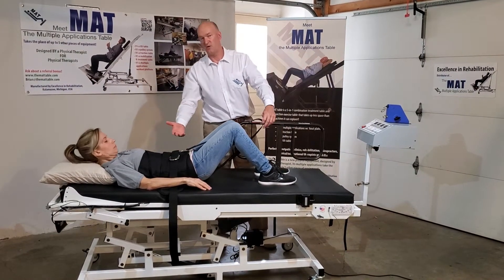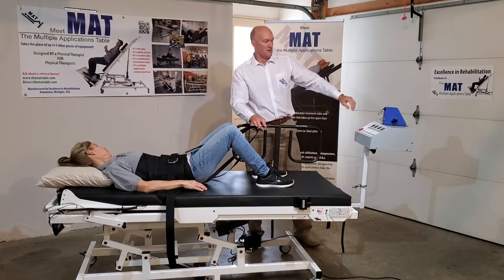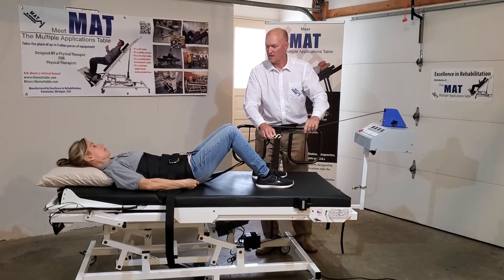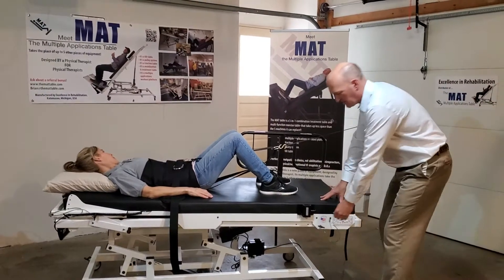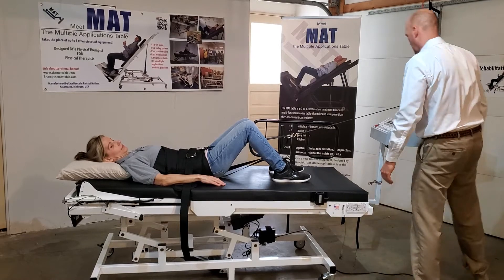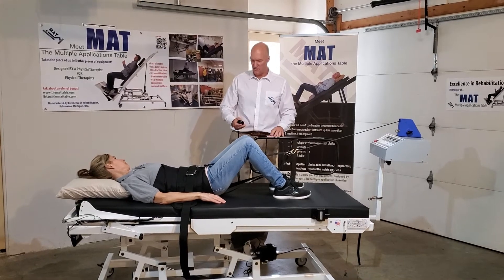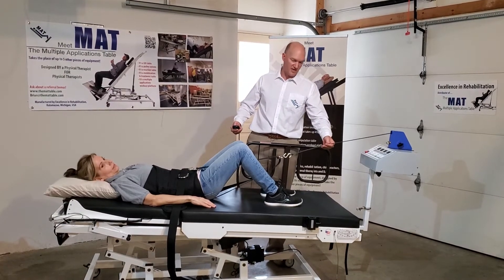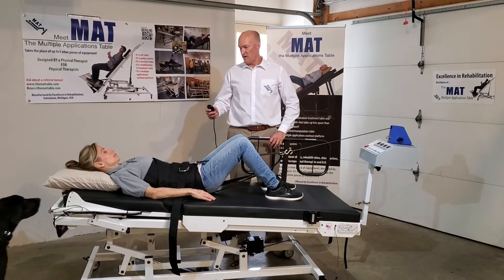The lumbar traction will pull on the pelvis from the top and the bottom in this fashion. The traction motor has to be engaged — we hook that up. We undo the table brake so that it will glide apart, and it's already started. The multiple applications table also has the ability to do some inclining, which can help start the traction process even before you engage the motor. Now we are all set — the table is split and the patient is already engaging in some traction.